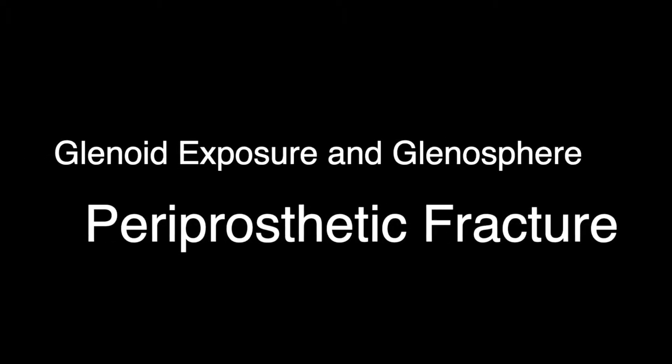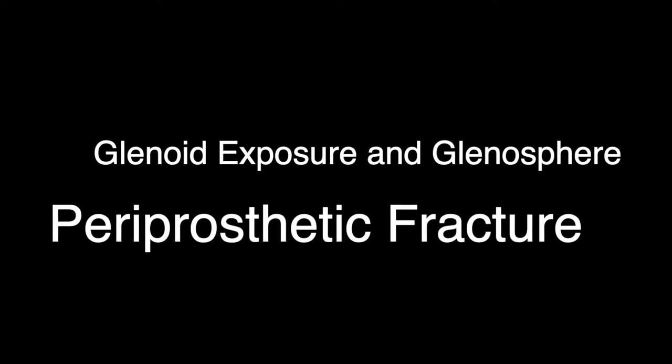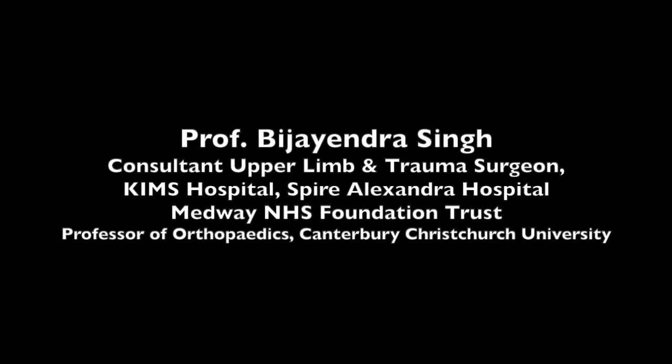Hello everyone, this is a short video showing exposure of the glenoid in the case of a revision shoulder arthroplasty.